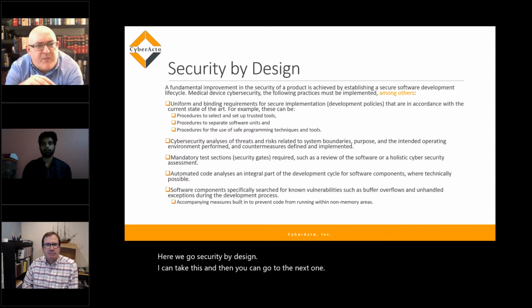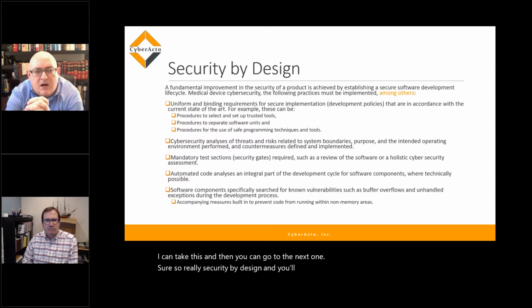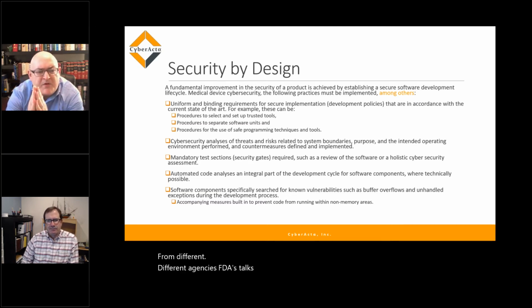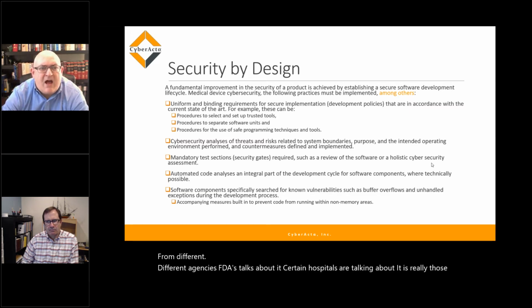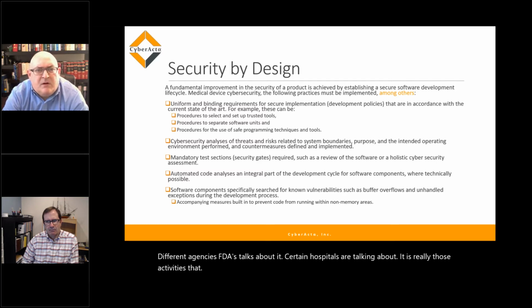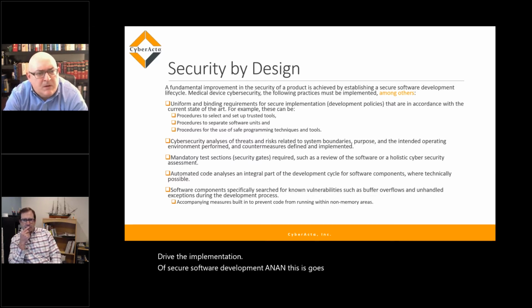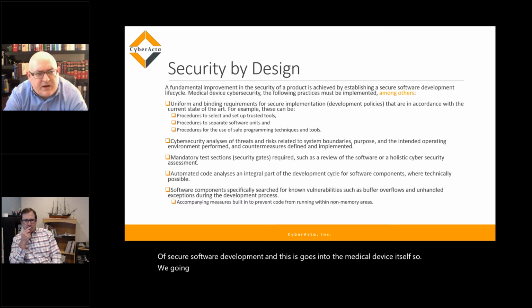So really, security by design, and you'll hear it a lot from different agencies. FDA talks about it. Certain hospitals are talking about it. It is really those activities that drive the implementation of secure software development, and this goes into the medical device itself. So we're going into what are those starting points, do we have the uniform and binding requirements for implementation that demonstrates that our product is state of the art.